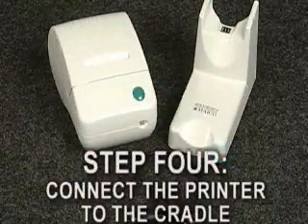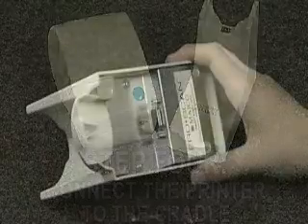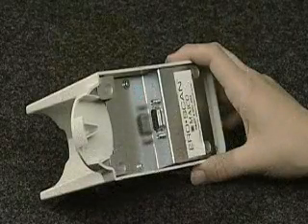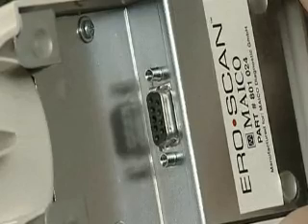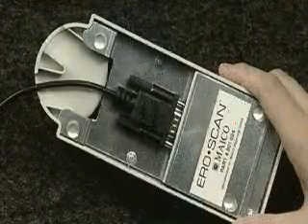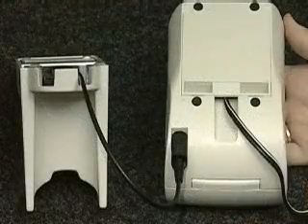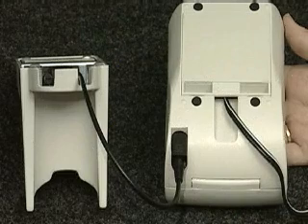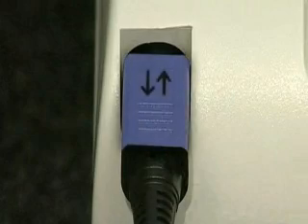Finally, in step four, connect the printer to the cradle. Turn the cradle over and connect the printer cable to the nine-pin port — this connector will fit in only one direction. Once it is firmly seated, turn the two screws to secure the connection. Next, turn the printer over and connect the plug to the port on the right side of the printer. The flat side of the cable with the arrows should face up. The setup process is now complete.